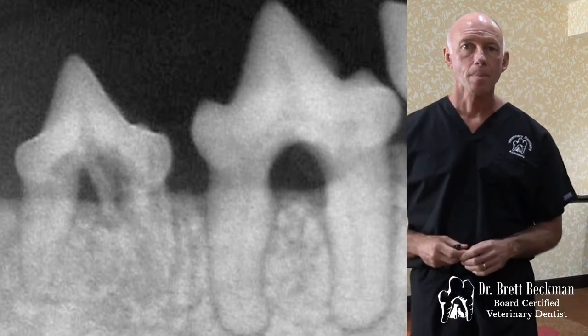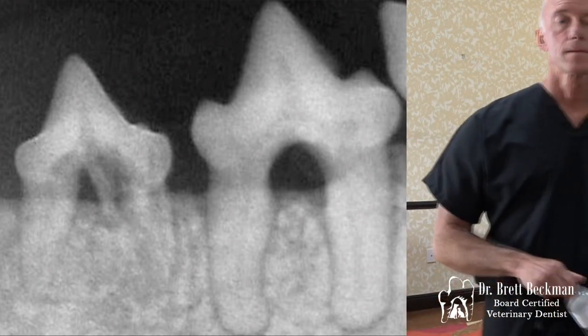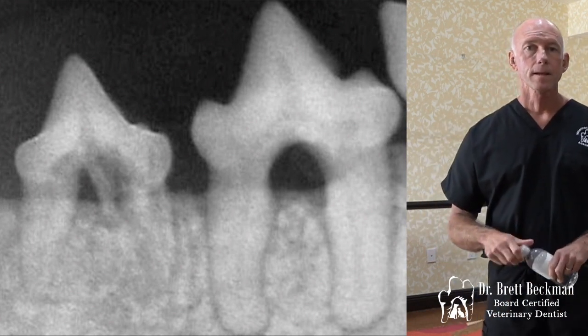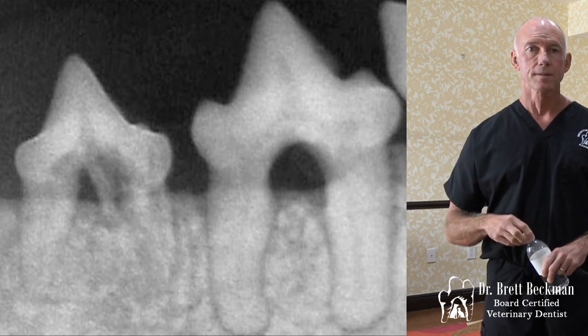So how can you tell how far apically you have to go? Like if you're in there debriding, how do you know when you've got all the granulation tissue out and when the rest is resorbed and you're not going to get it? Like, how do you know when to stop? It's a combination of radiographically and visual observation.